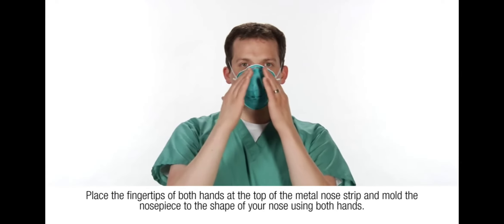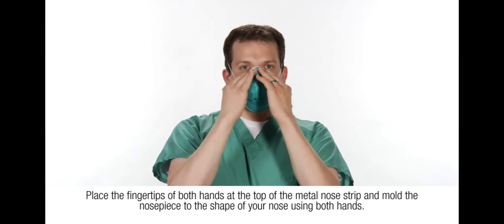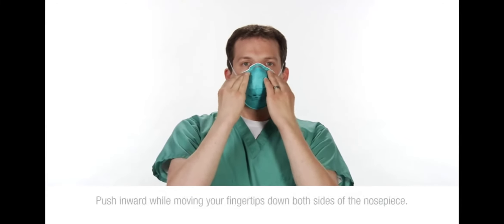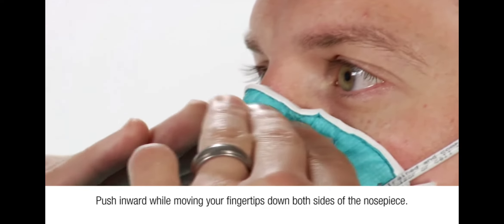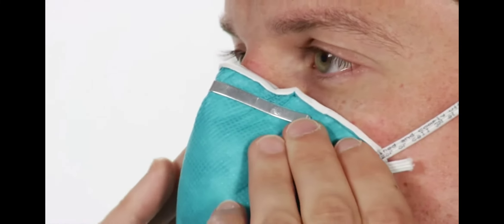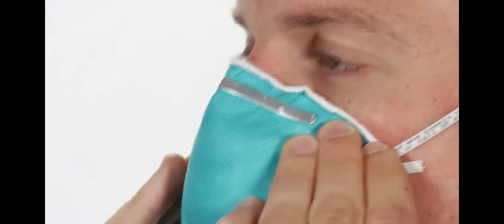Place the fingertips of both hands at the top of the metal nose strip and mold the nose piece to the shape of your nose using both hands. Push inward while moving your fingertips down both sides of the nose piece. Always use two hands when molding the nose piece. Pinching with one hand may result in improper fit and less effective respirator performance.